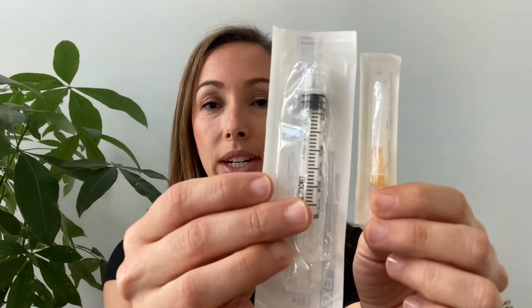The first thing you need to fill your tandem pump cartridge is obviously the cartridge itself. Inside that same box of cartridges you're going to find a needle as well as a syringe.